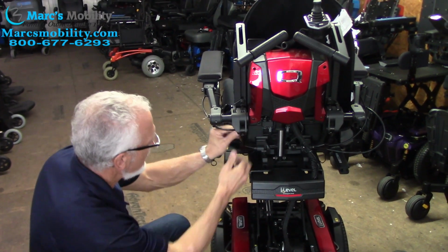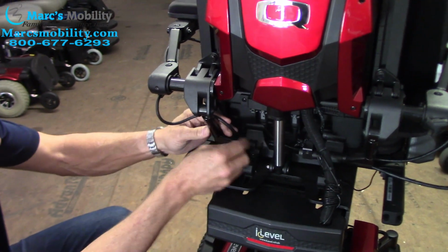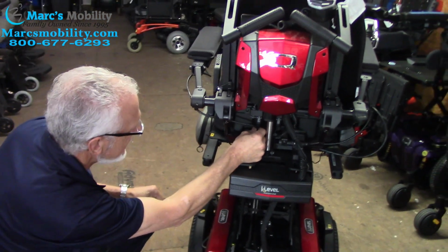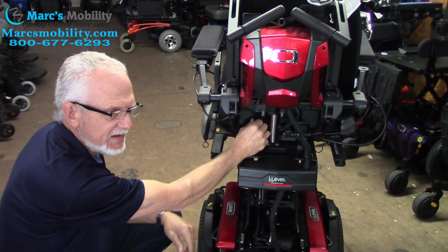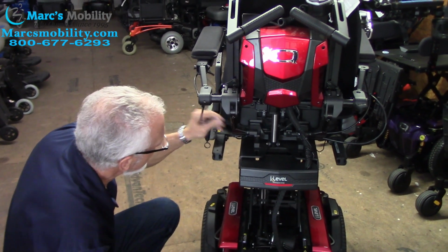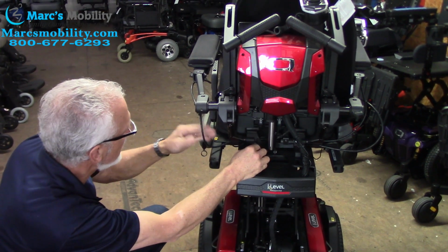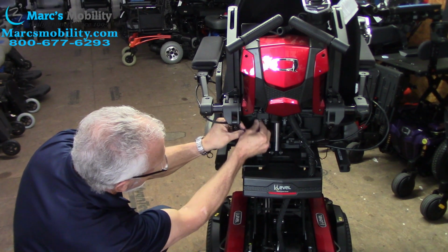Just bring the cable behind this little rod here. You'll have this little rod. Just bring the cable here, plug it here, and you can just zip tie it. You can just zip tie it here. Make sure when you recline the seat, the cable does not get pulled or anything like that, okay? Give it a little bit of loose, but you don't have to go through the hole again and bring it here. You just have to go right behind this little thing right here and hook up your cable right there.